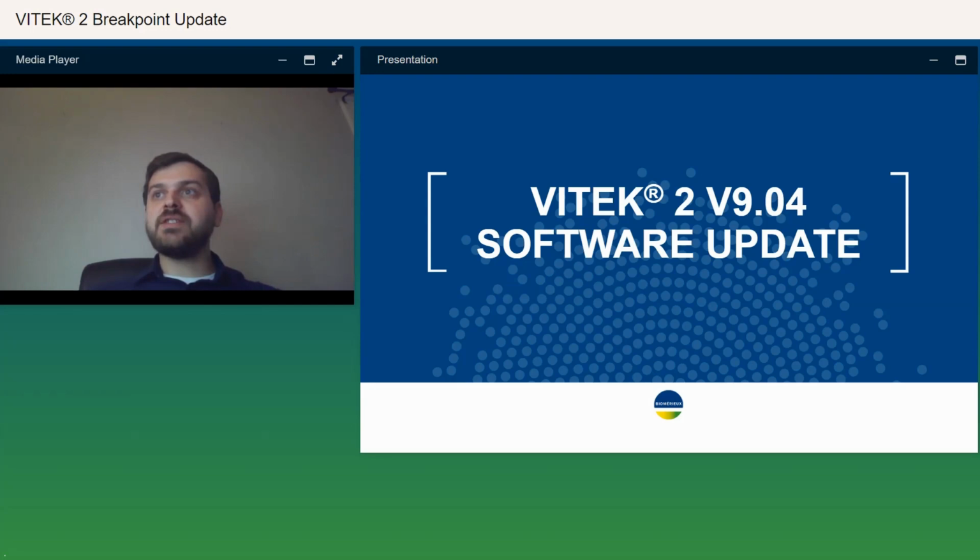So as discussed, there are some interdependencies for these new cards, right? We need the software version 9.04 in order to run the new cards with the new drugs. So of course, we're evaluating all of these interdependencies carefully as we finalize a phase out plan, which we will be communicating with the rollout of the new AST cards later this year. And my big point is that, of course, we're taking a close look at all of this, and we are going to work with our customers for a smooth transition, enabling everyone to make the move to AST cards that will allow compliance with these current breakpoints.